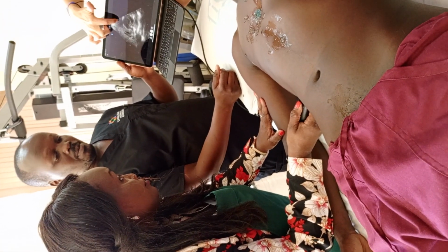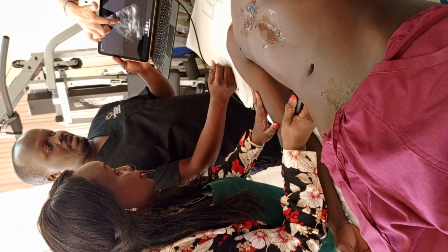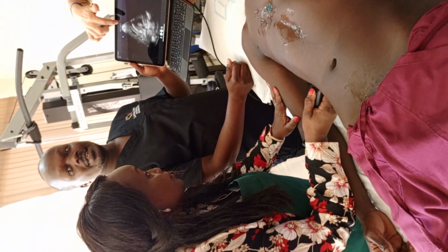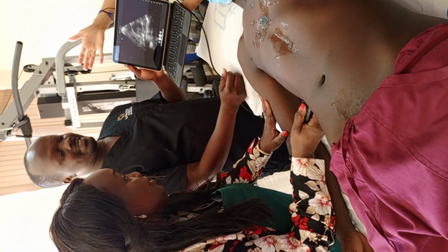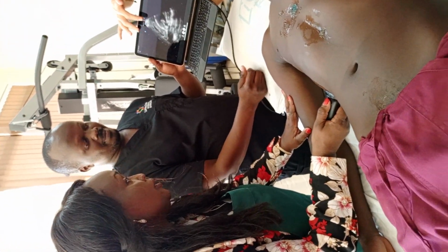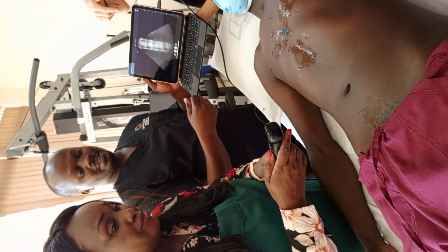Beautiful. So here's liver. Here's kidney. What's this white line? What is it? Morrison's pouch. That's a potential space. He has no free fluid in there. Yay. So you have a beautiful view. Amazing. Okay, now let's move to subxiphoid.